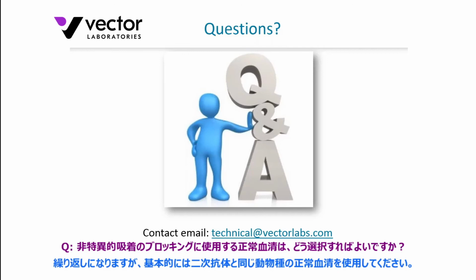So the criteria is using serum from the same species in which the secondary antibody is raised. It's a non-reactive material, and therefore that's the recommended approach. As I mentioned, there are alternatives such as an animal-free or a plant-based blocking reagent as well. So certainly there are alternatives out there to serum.